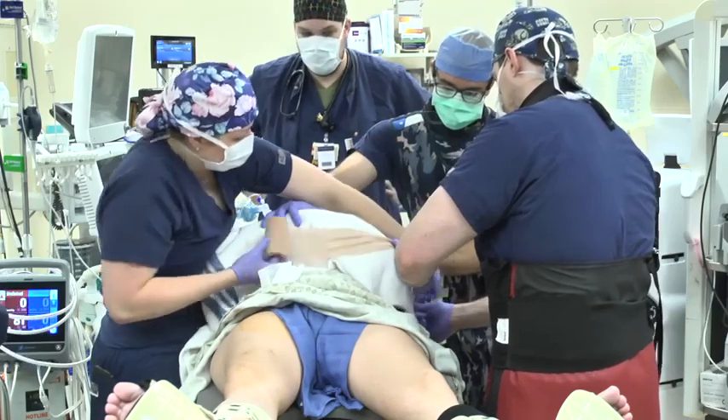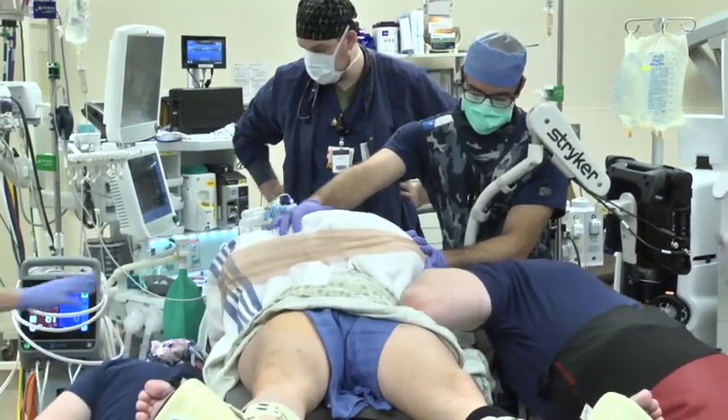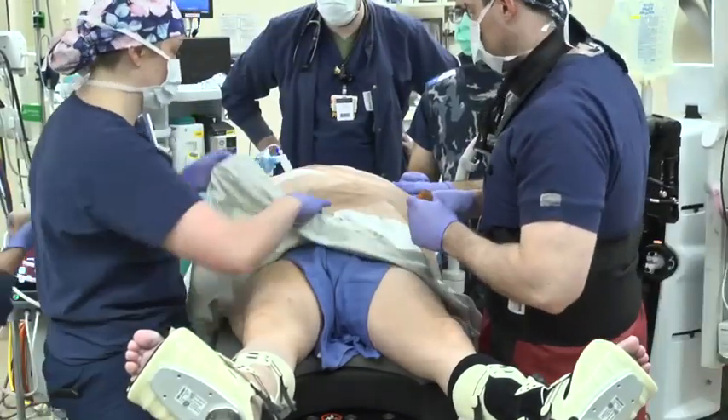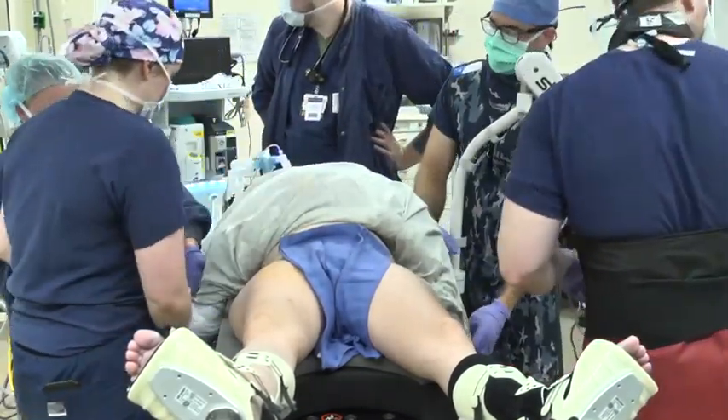The IV is then checked for continued infusion. A blanket is placed over both arms and secured into position with circumferential co-band. The patient's gown is then flipped up over the patient's arms and co-band once again used to secure the arms.